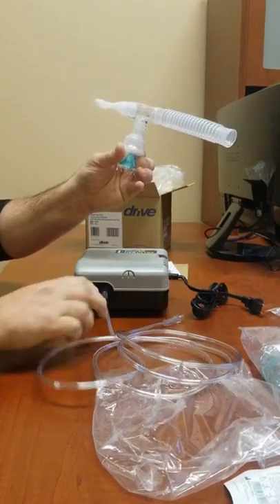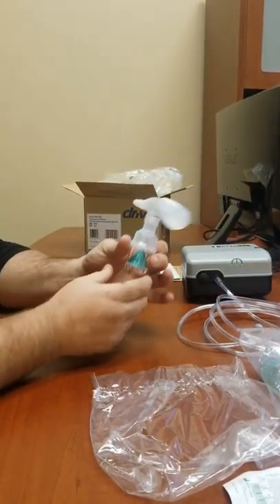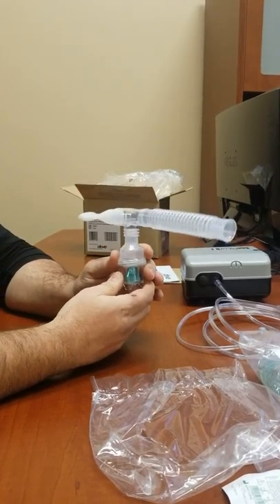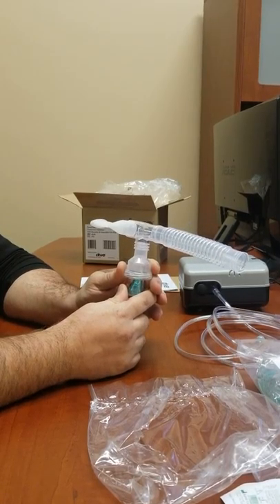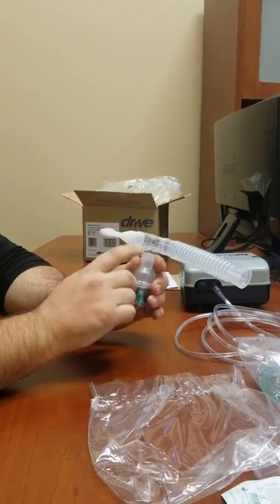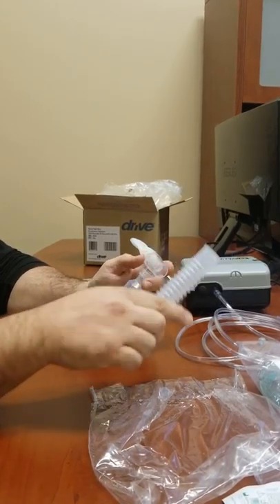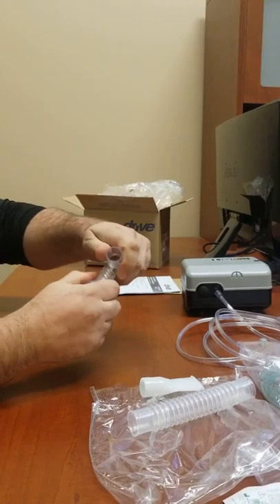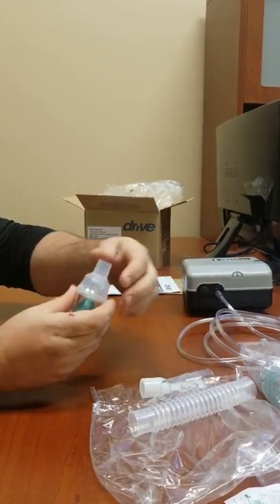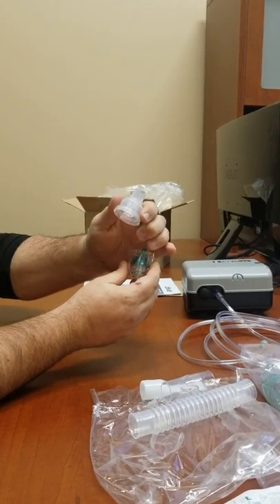Your tubing should come off. After every use, you'll want to rinse your neb kit under warm water. Do not dry it — let it air dry, so that way you don't breathe in any particles. Take every little piece off and rinse it all out with warm water.